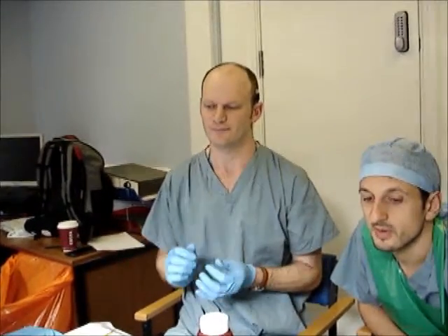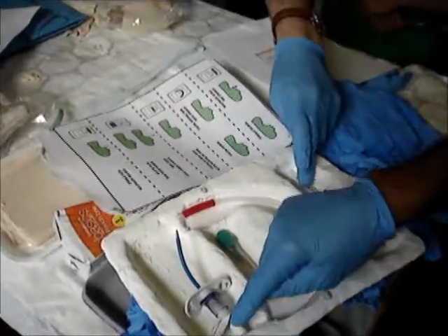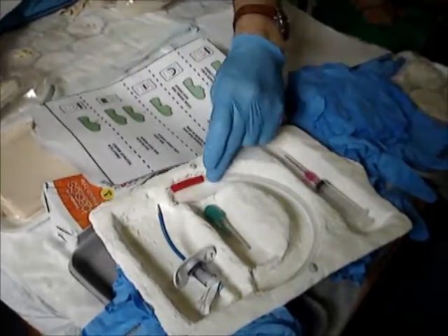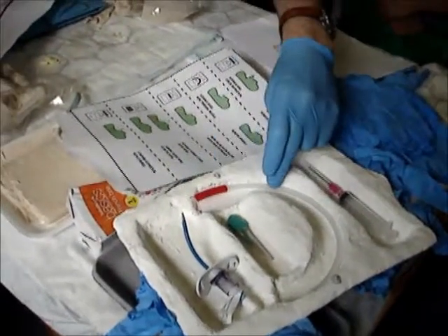Could you make that double sided? But I think having this pre-done is brilliant. Pre-done dilators, yeah, because that makes a big difference. I do think that if you had an arrow, just a big arrow pointing which end goes in.